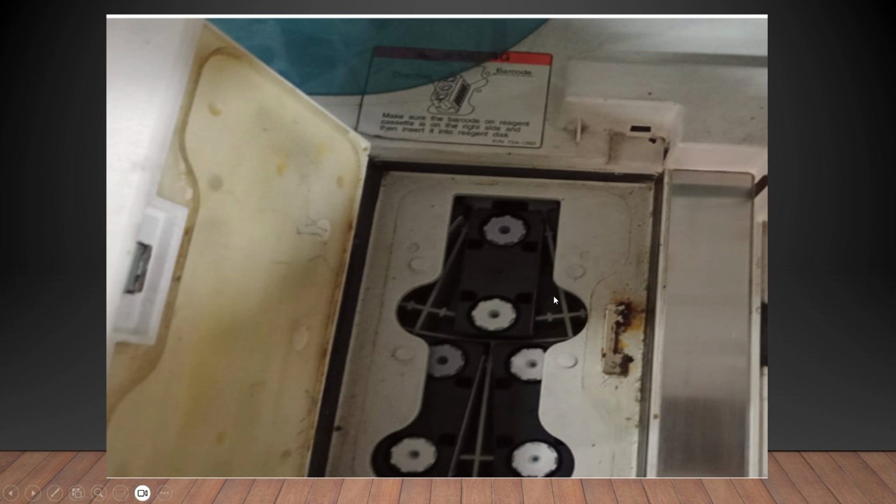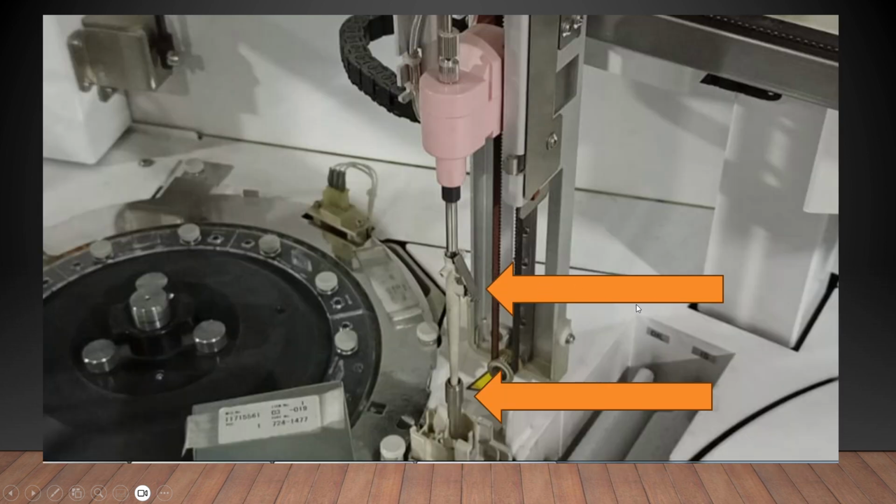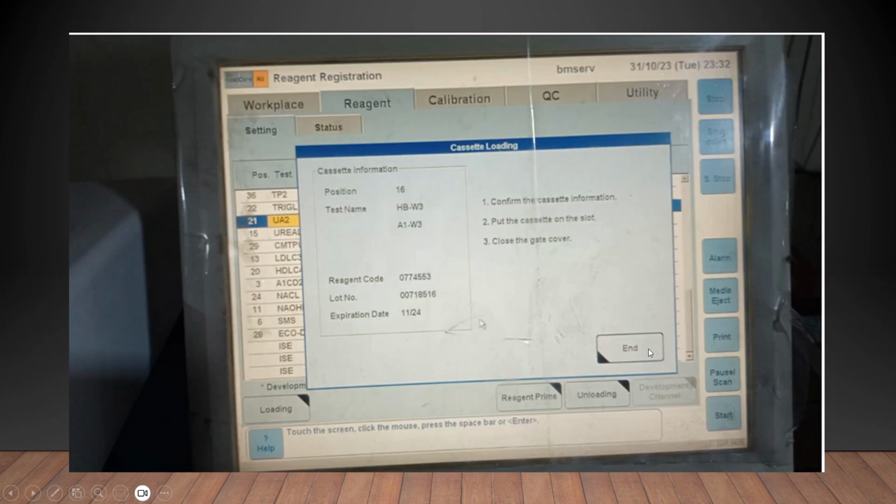Inside, it is air conditioned, with controlled temperature monitoring. Because of that, if you don't close it on time, it will always stay open, and after that when you try to close the door, it will not close. The air leak, temperature leak, everything will happen, and at some point of time the instrument may stop. So when you're adding the reagent, be meticulous and make sure that everything is done there and then itself.